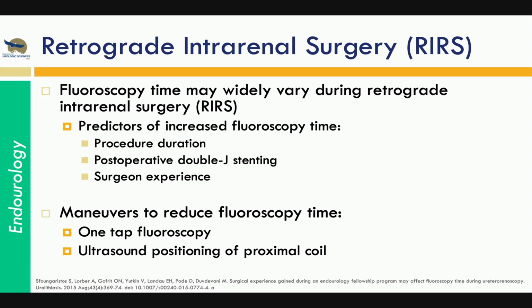Okay. And the last thing I'll talk about specifically in urology is in terms of ureteroscopy and stenting. There's a lot of fluoroscopy, and usually not that much of a consideration until you're talking about somebody who's pregnant, for example, and you really want to minimize radiation. So I looked into the literature, and there's not really any proof of concept papers about the idea of using just ultrasound, and no fluoroscopy at all in these retrograde cases.